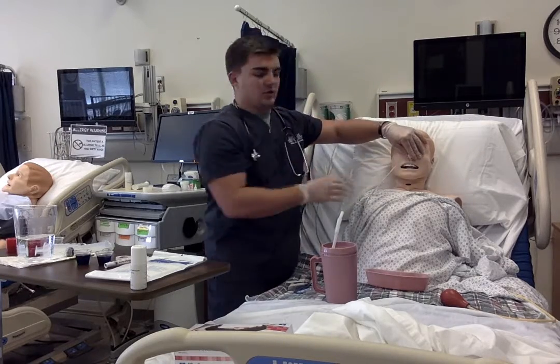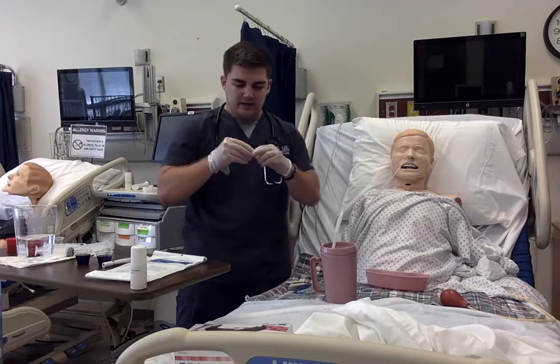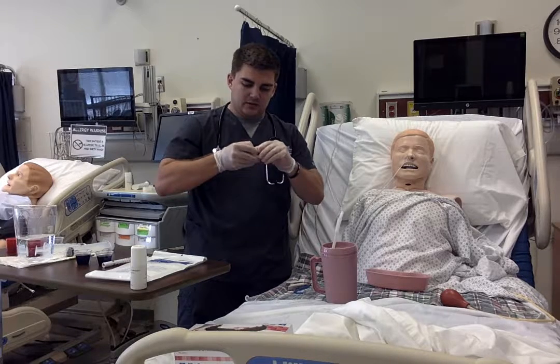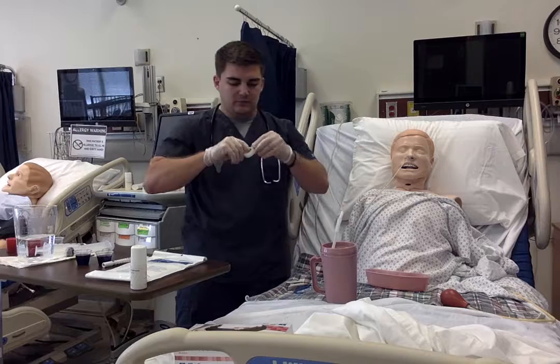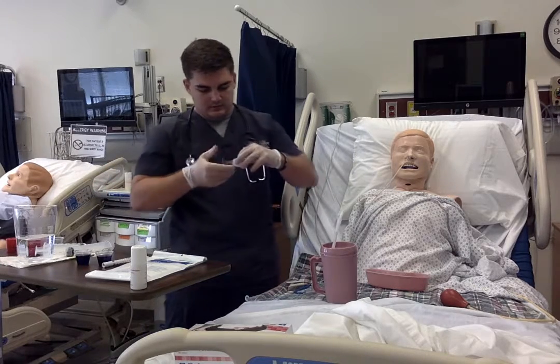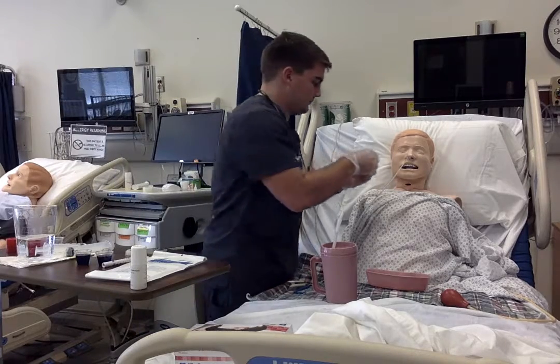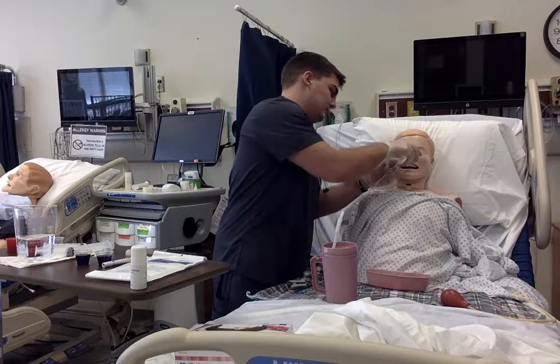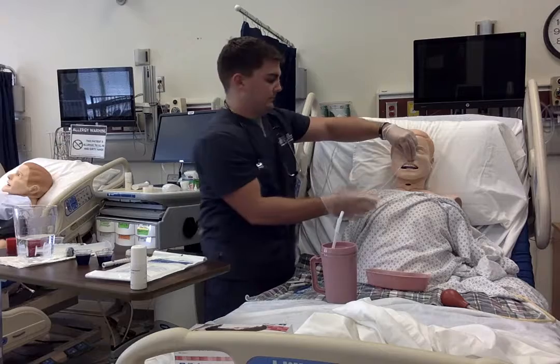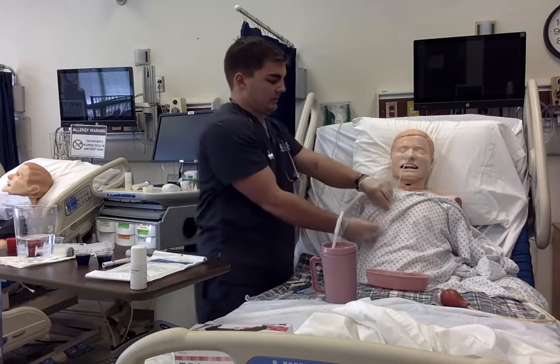In case of tube misplacement, if the patient moves their head or anything, I'm going to put a flag on the tubing so I would know if the tube had moved or not. It would be a simple flag made by putting the tape together. Then I would get a safety pin and secure the tube to the patient's gown.